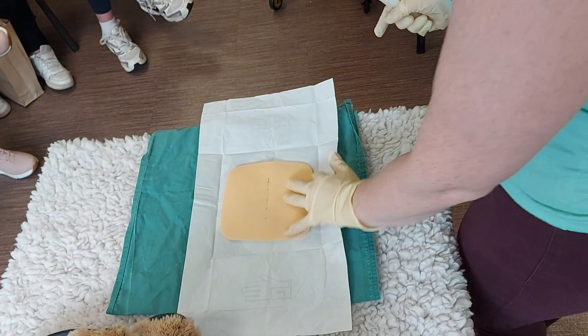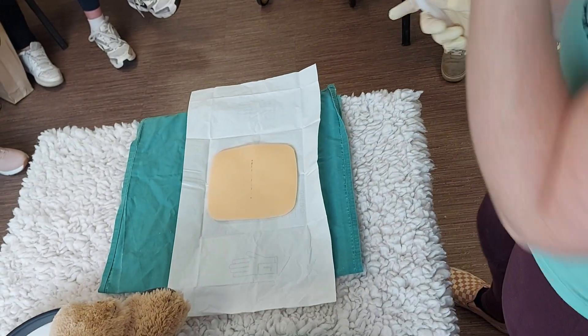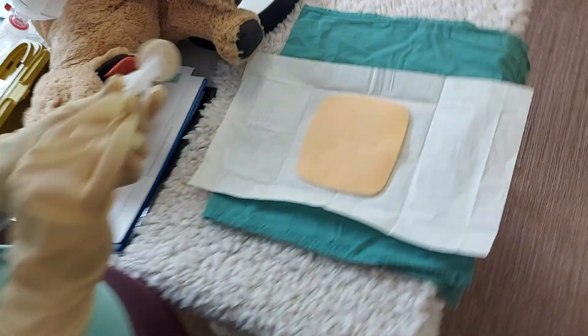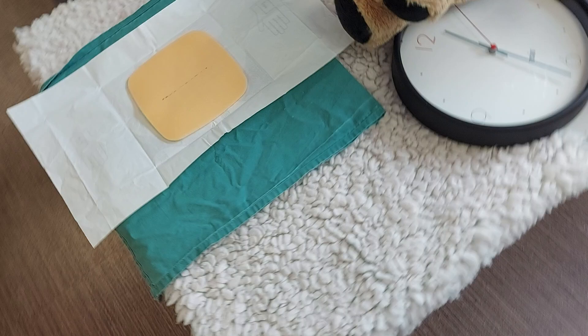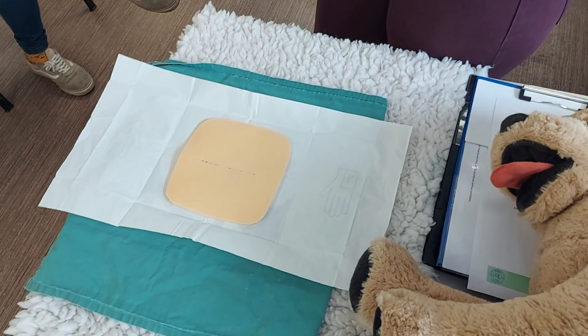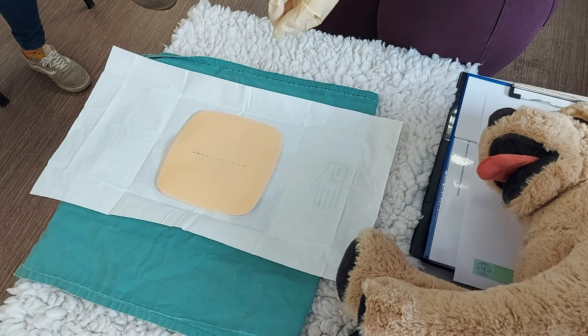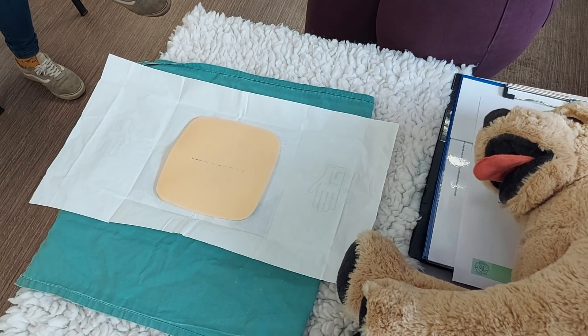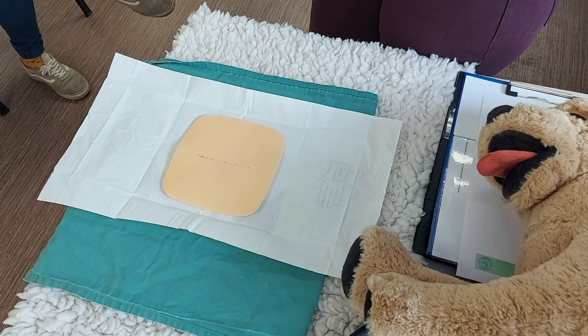The approved ChloraPrep technique — you cannot use a circling motion, you have to use the approved technique. Victor are the people that have made this product, and as mentioned, it's based on blood donation. This is the technique they've studied that cleans the skin the most when you give blood, so it's very evidentially based — it's the best technique.